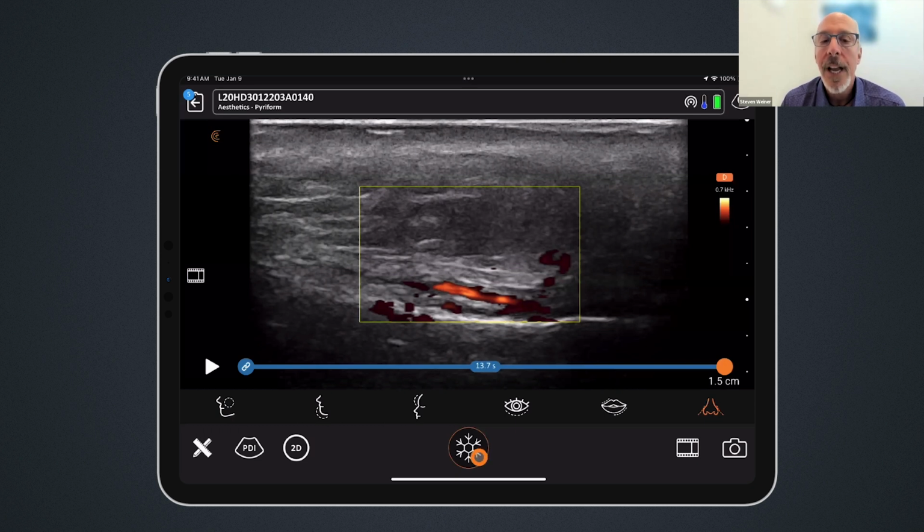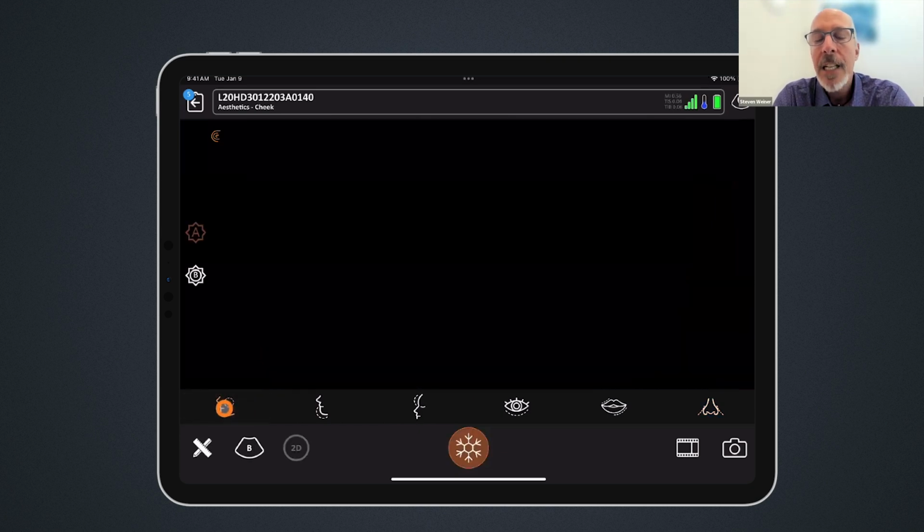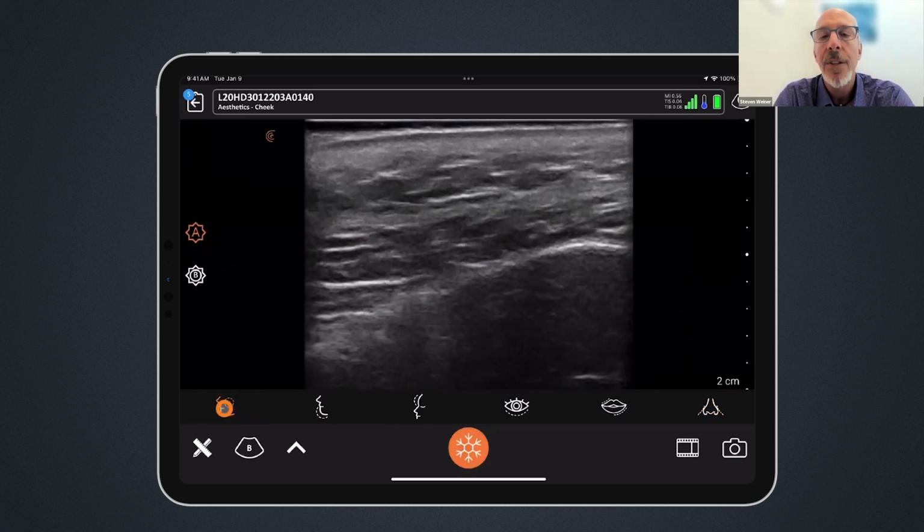Now, the literature states that about 4% of patients have it on the bone. However, newer ultrasound data suggests it's closer to 20 or 25%. Wow. Also, I've been fooled a little bit. I hadn't seen some very small vessels.